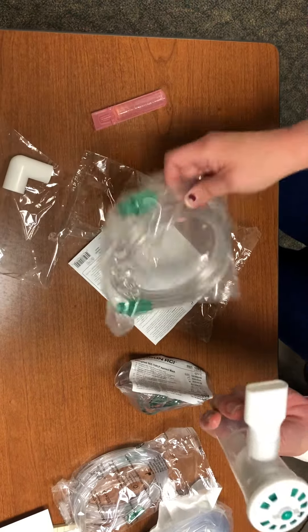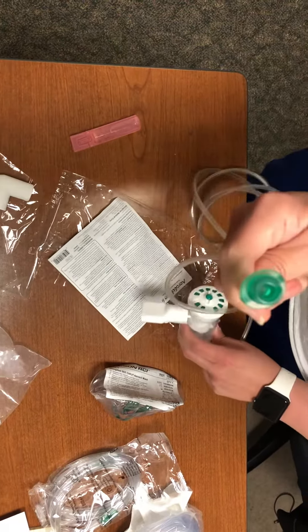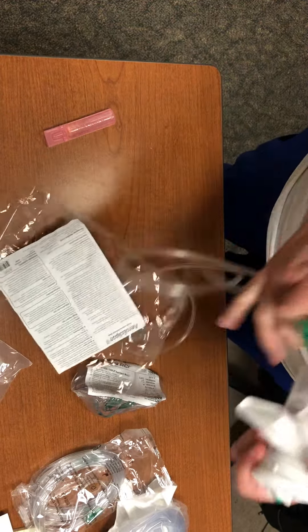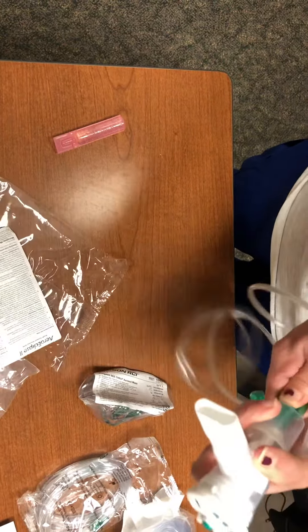You'll need this piece, and then you're going to open up the oxygen tubing. One end is going to go onto your flow meter on the wall — you can use air or oxygen depending on which they need. The other piece is going to go on the end here. Slide it right on and give it a little twist; it's not as easy to get on.